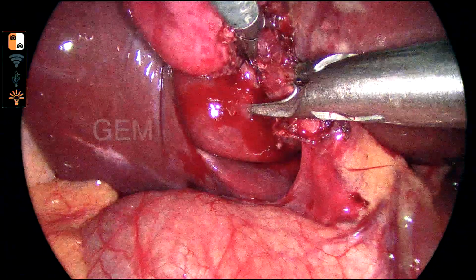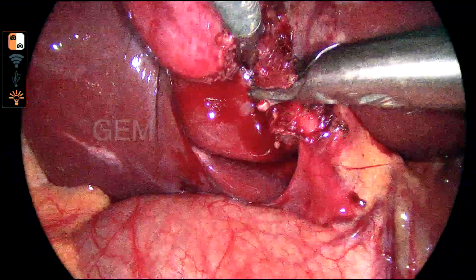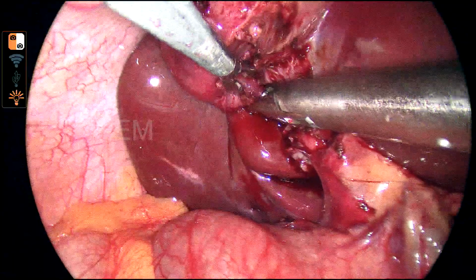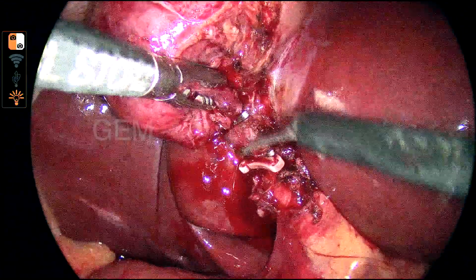Routinely I use a medium-large 9 mm, but this is a large 11 mm clip, because of this thick edematous cystic duct. Again an 11 mm clip, otherwise called a sentinel clip, on the infundibulocystic junction. So 3 clips applied. Now I am dividing the cystic duct.